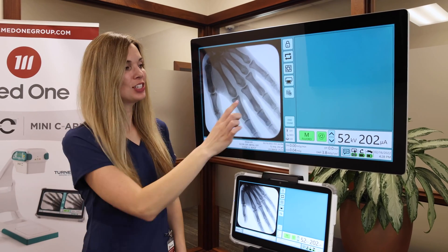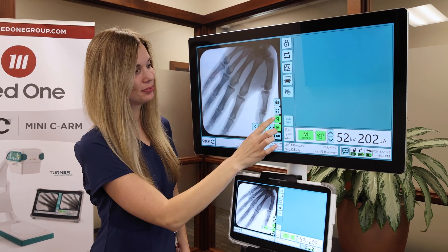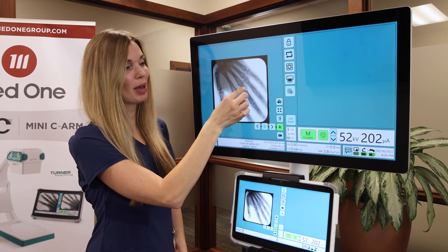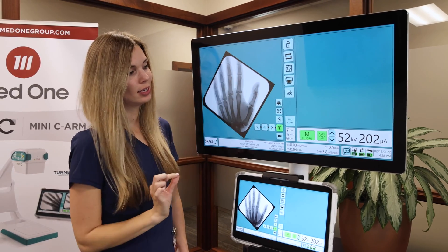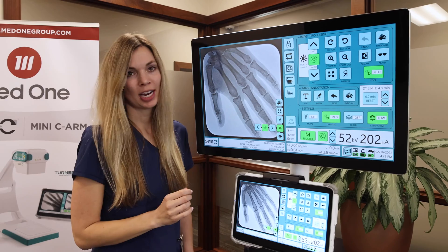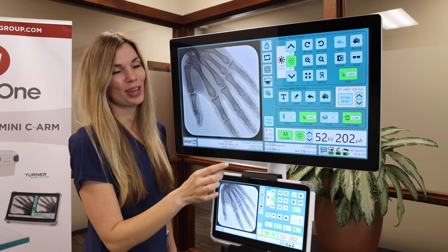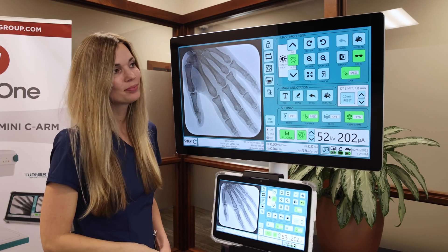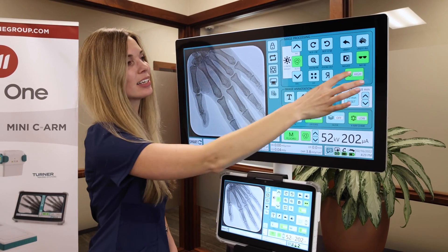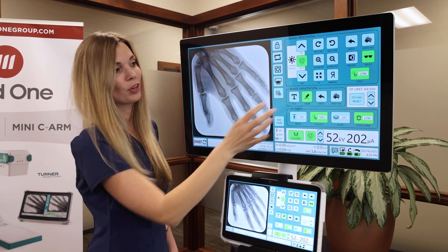Now that you've taken an image, you can touch your main window for some image adjustment buttons. You can mirror your image, adjust your contrast and brightness, use two fingers to zoom out or zoom in, and rotate your image. To undo those changes, simply hit undo. If you swipe to your image processing screen, you have these same buttons as well as a few more — you can negate your image, remove personal identifying information, enhance the edges of your x-ray to your desired preference, and annotate on your image with either a text box or by drawing on it.